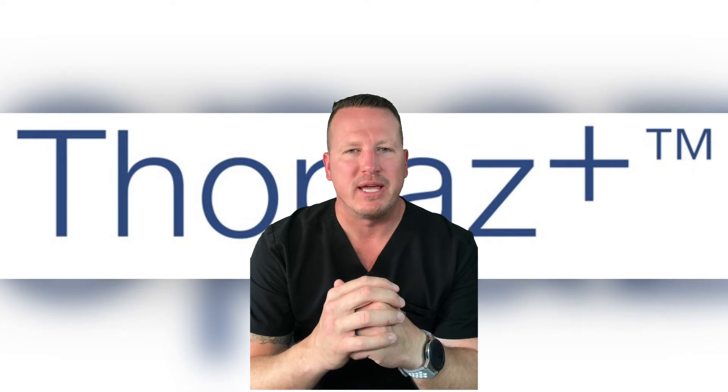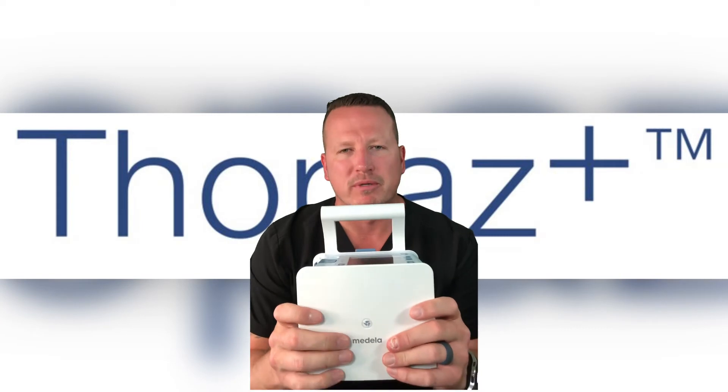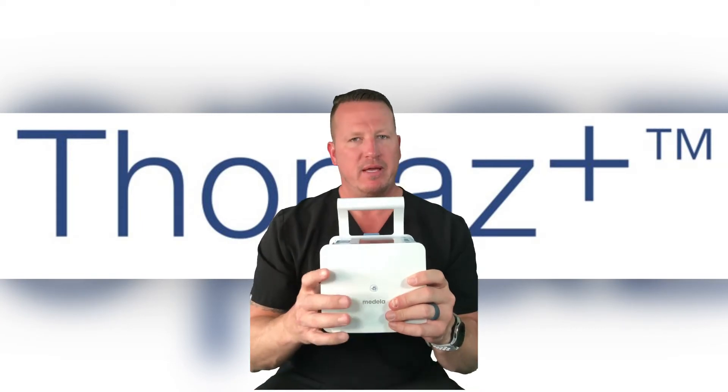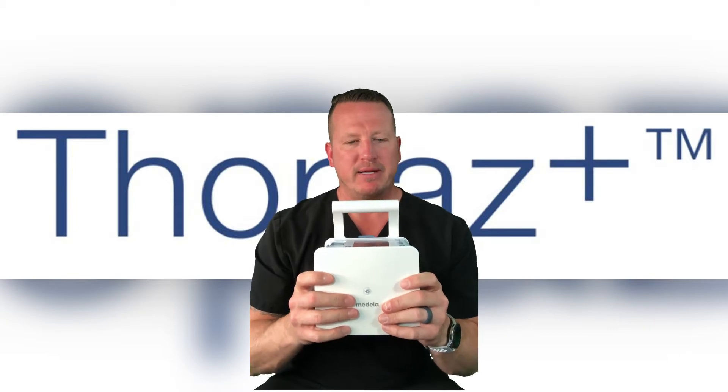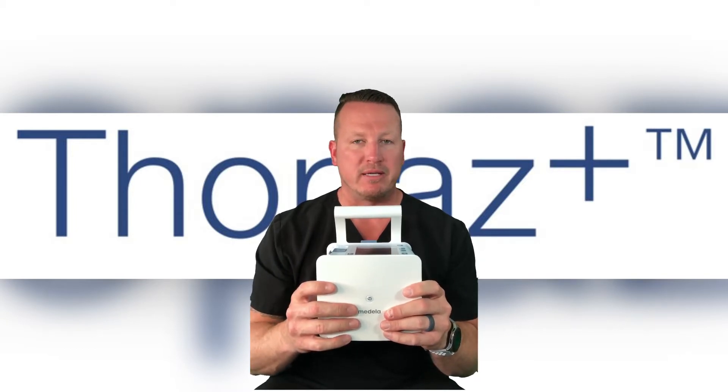Welcome to Topaz Plus Education. Topaz Plus is a reusable digital chest drainage and monitoring system that's battery operated with an average battery life of about 10 hours on a moderate air leak and weighs only 2.2 pounds without fluid.